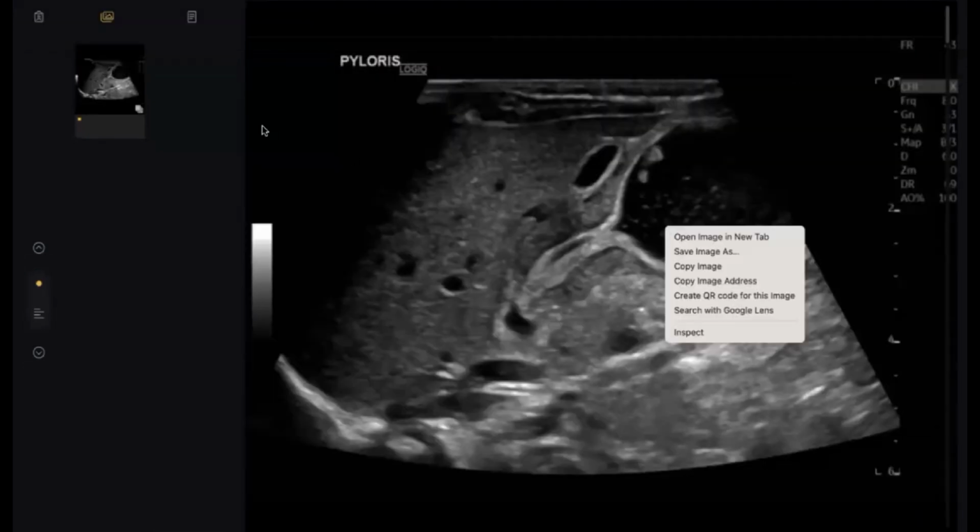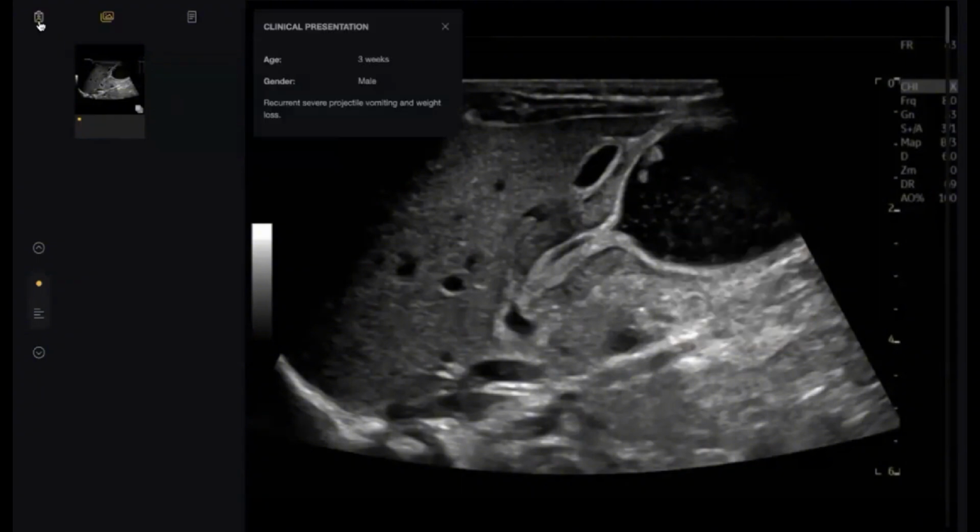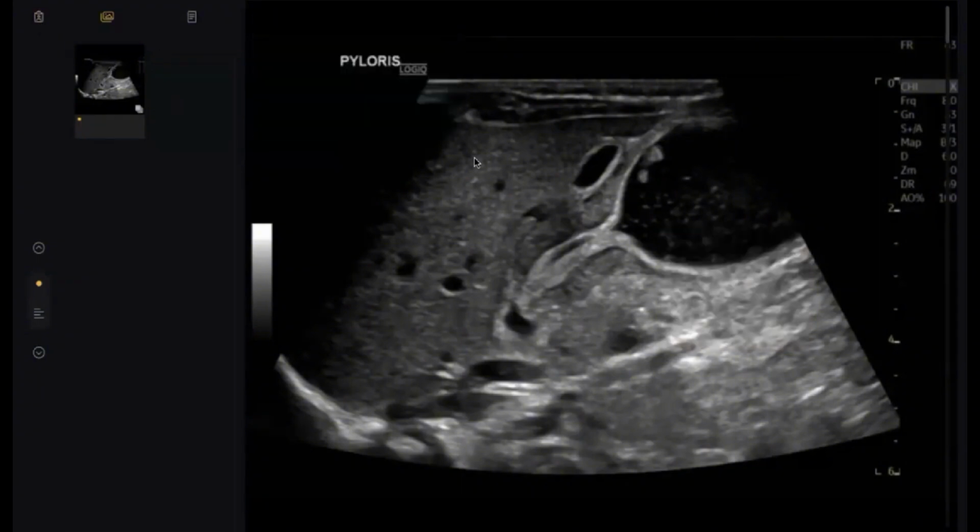Hello. Welcome. Three-week-old male patient with vomiting.